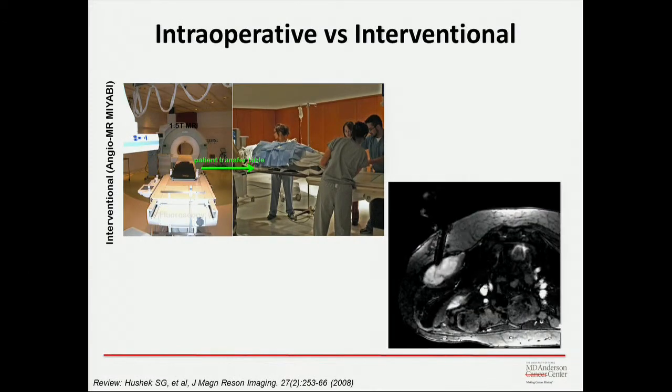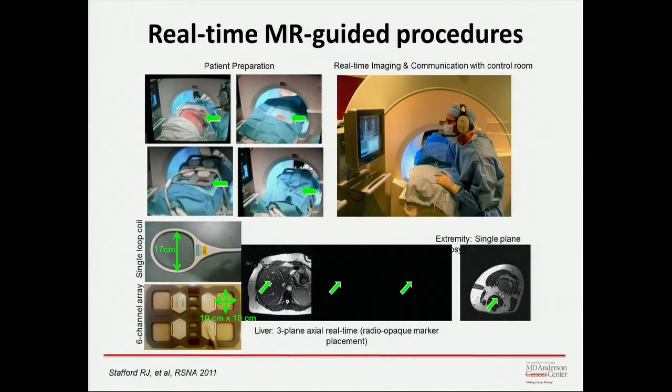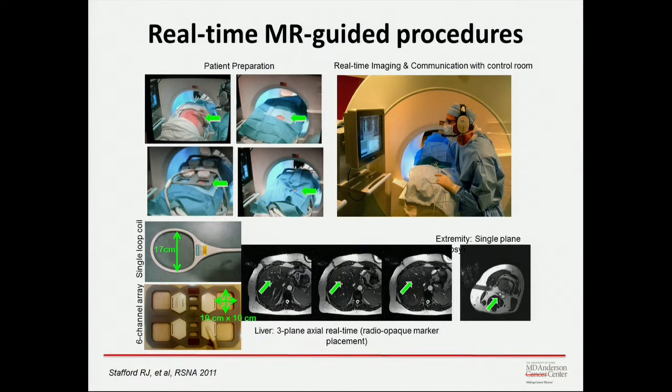We also want to use this technology in interventional radiology where speed is critical. So we want to be able to track devices in real time and get them targeted to locations that we may only be able to see with MR. This is a lipoma that you can actually see very easily on the MR. It's very hard to see on CT, but you can see this device being inserted in here, and they're going to do a core biopsy. So we can use this to guide that. We've done a lot of work looking at different applications. The interventional radiologists have a whole different set of new tools that they use that all have to be developed to be MR compatible.